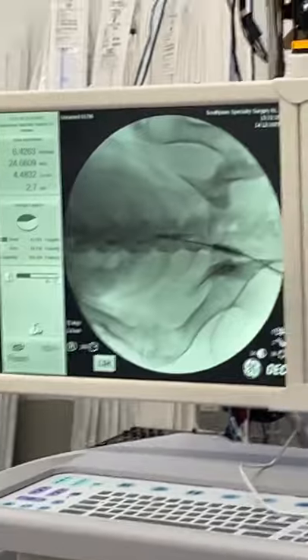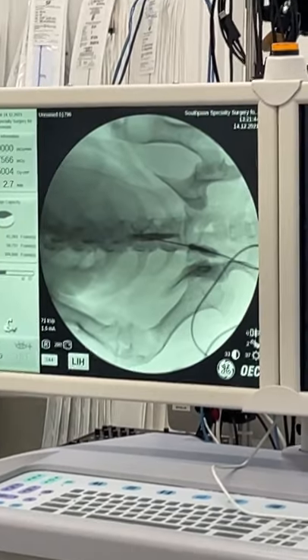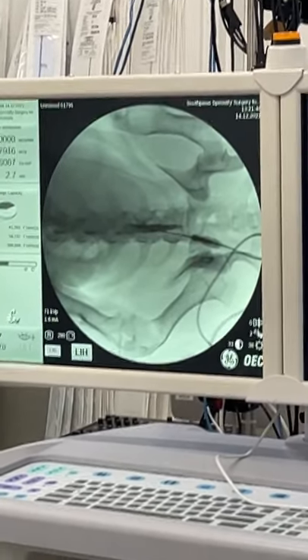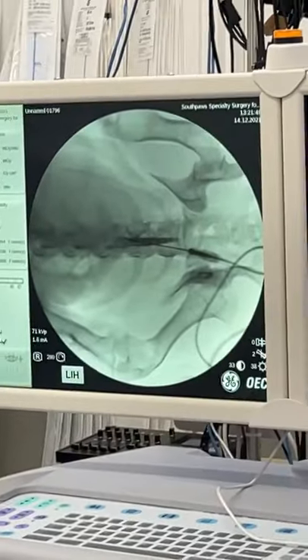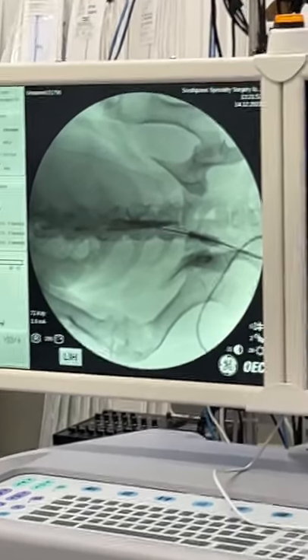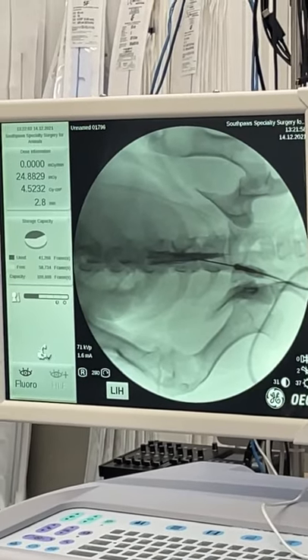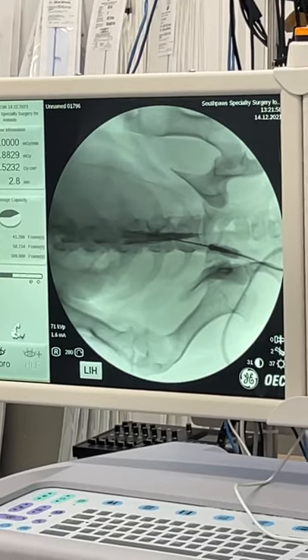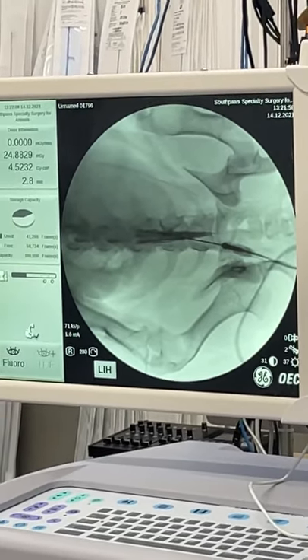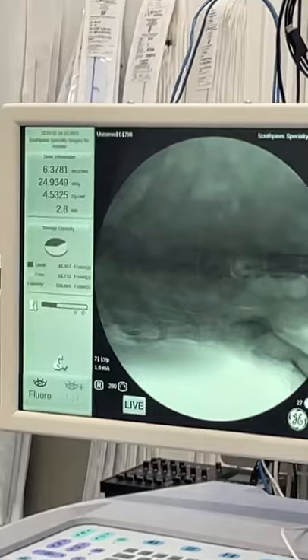If you come around and look at the screen, you can see that every time we take a new fluoroscopy image the black indicates the contrast that's running through. As time continues the contrast is consistently running cranially up the dog. You want to make sure that you inject very slowly because you can blow through the hole that you've made in your arachnoid with the needle if you're not careful. So we just want to inject nice and slowly with repeated injections all the way up.